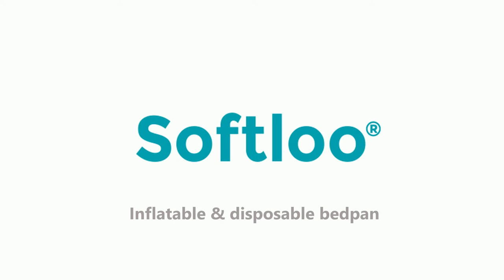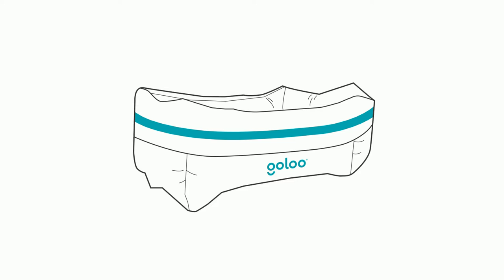SoftLoo is easy to use, an inflatable and disposable bedpan. It is comfortable for patients and it reduces the risk of infection.